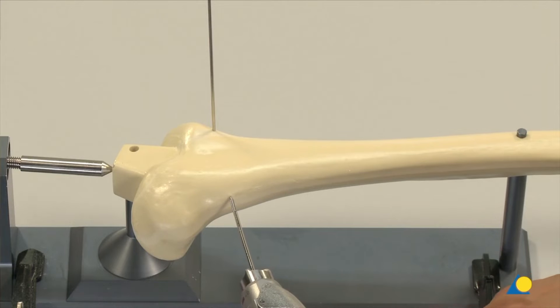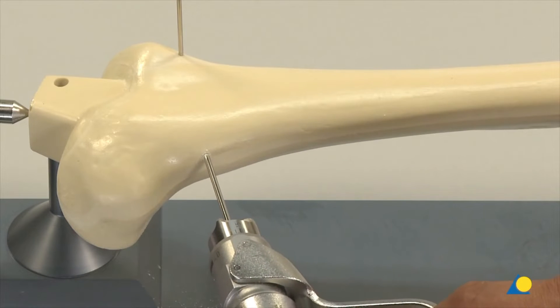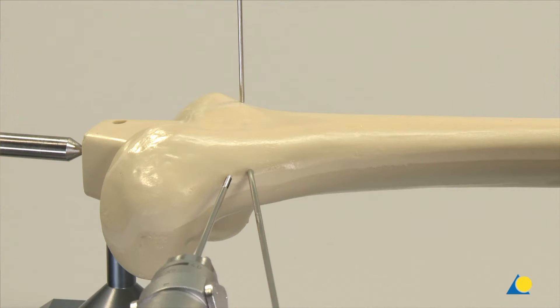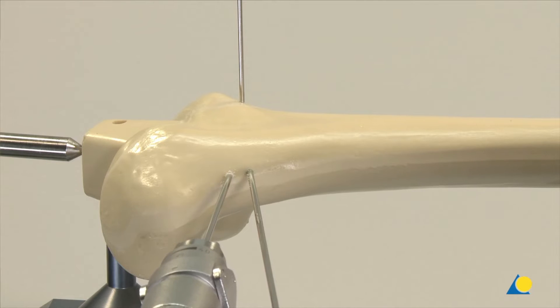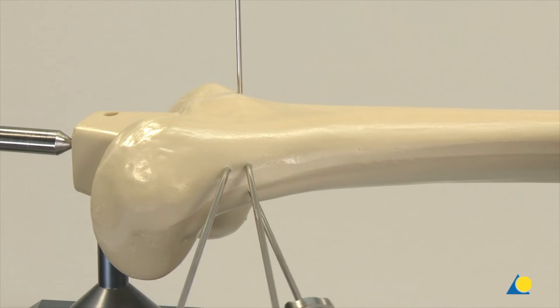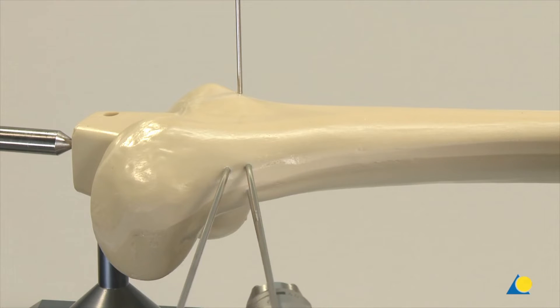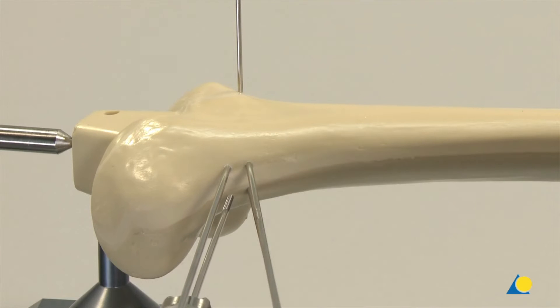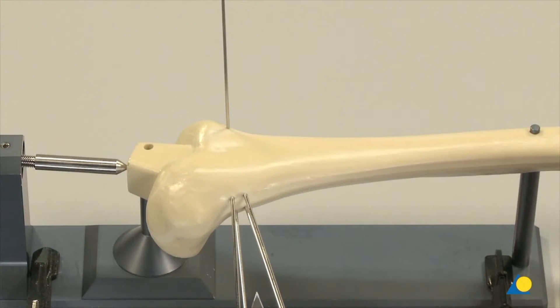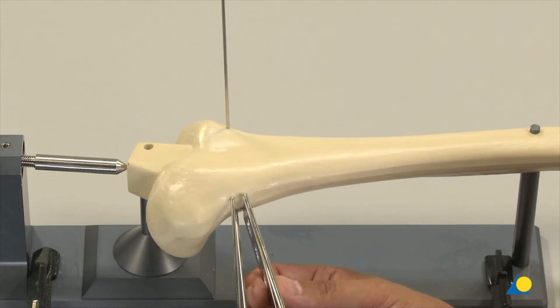Two K-wires, which are aimed to coincide at the hinge point, are inserted. The distance between the K-wires at the entry point is based upon the preoperative planning. Two additional K-wires are now inserted parallel and dorsal to the first K-wires. The transverse osteotomy cuts are made in the dorsal three quarters of the bone with an oscillating saw parallel to the K-wires, which act as a guide for the saw blade.